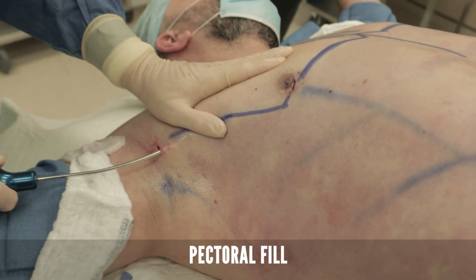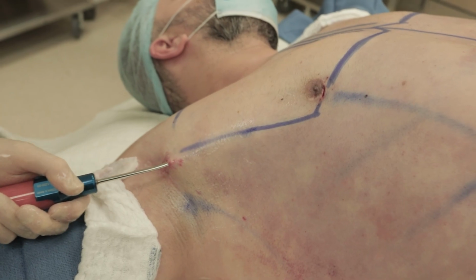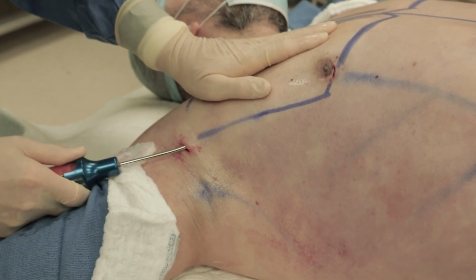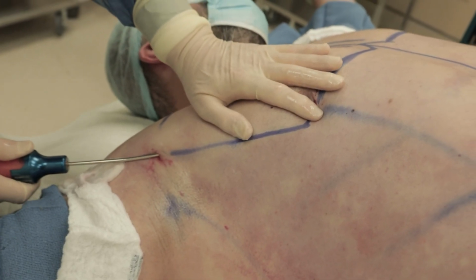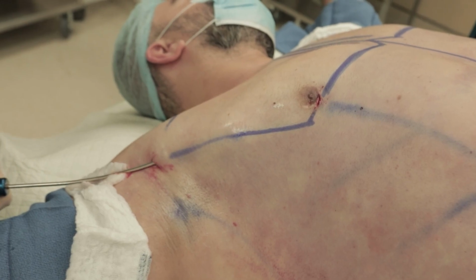Get right on in there. Remember, he had gyno surgery in the past with results that left a depression there. So I need to fill a little bit of that in. So he's got like a nice hockey stick look.